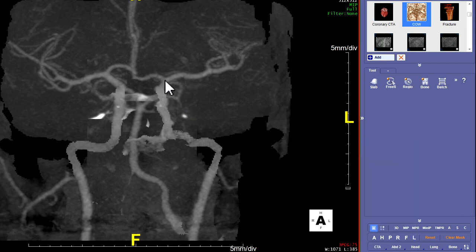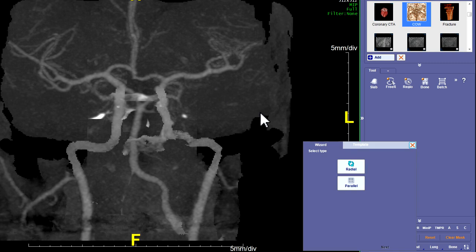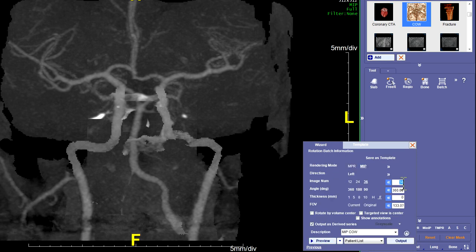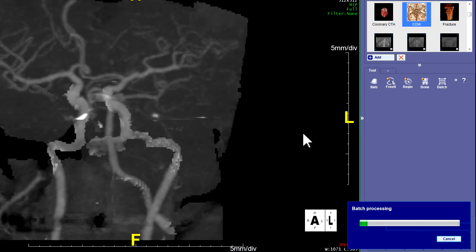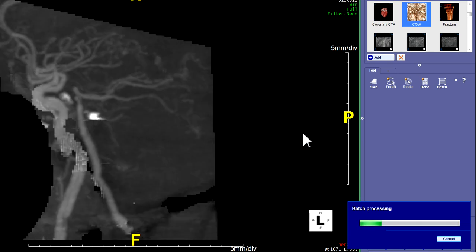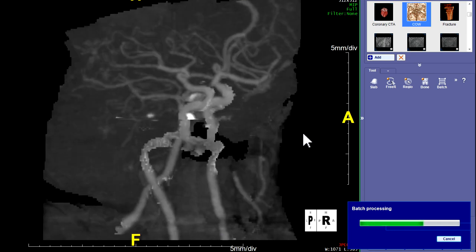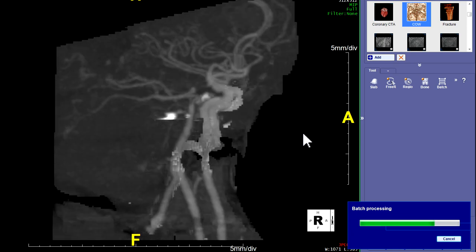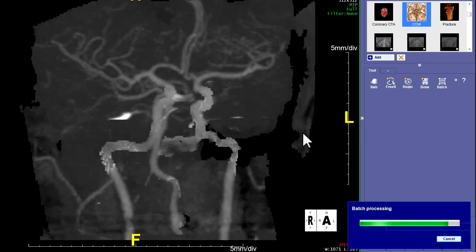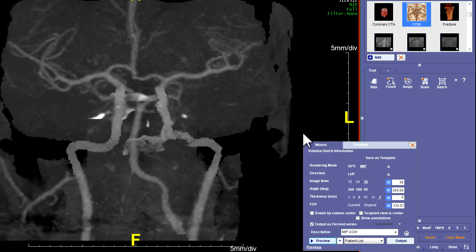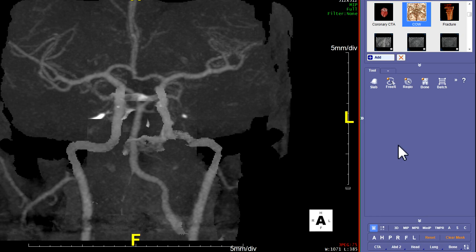Then all we have to do is spin it right to left, so F8 to open up the batch wizard again, hit radials. We spun it up this time, so now always spin it towards the right. Start with the anterior view, spin it towards the right, and all of our settings are the same. Hit preview to take a look at it, and that's going to look real good. We're looking at a one-on-one, so when we send it to PACS, we're looking at maybe four-on-one — it'll look even clearer. Hit the output to send it, and that's done.